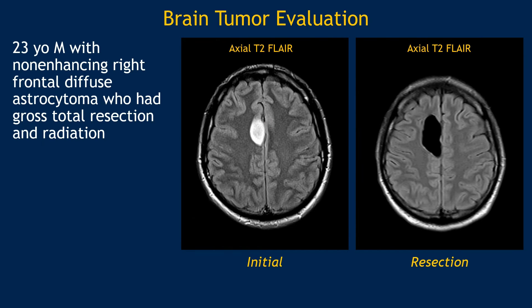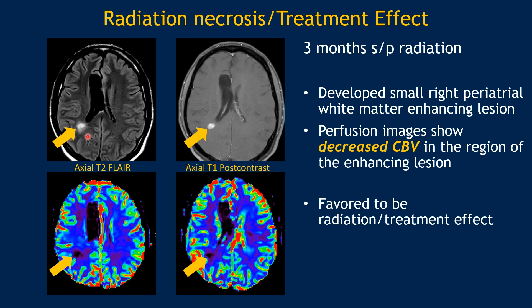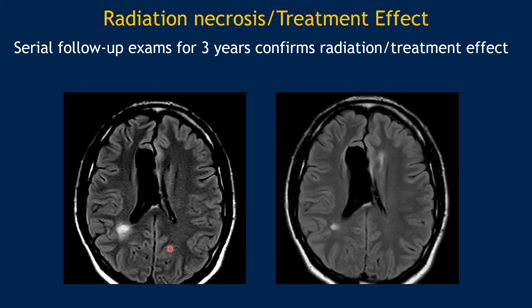This is another young patient who had a right frontal diffuse astrocytoma that was nicely resected. Three months after radiation therapy, a new lesion was seen in the right periventricular white matter showing some post-contrast enhancement. On conventional imaging, it would be difficult to tell whether this is recurrent or residual tumor. However, on DSC perfusion, that same area of nodular enhancement shows decreased or low perfusion, consistent with radiation effect. We followed this patient for many years, and three years later that same area decreased in size, confirming probable radiation necrosis or radiation effect.